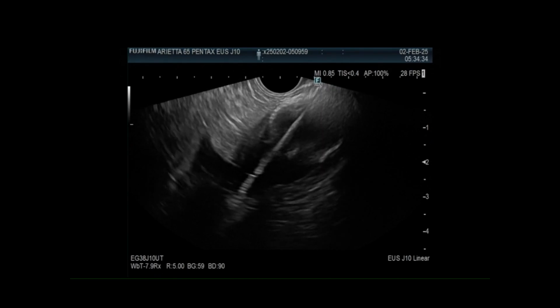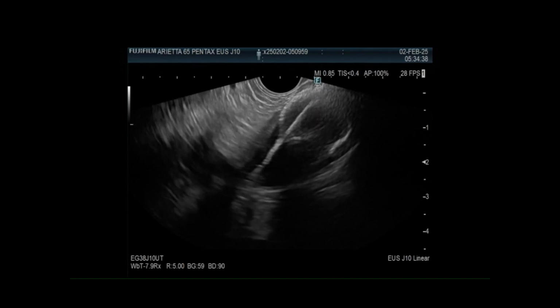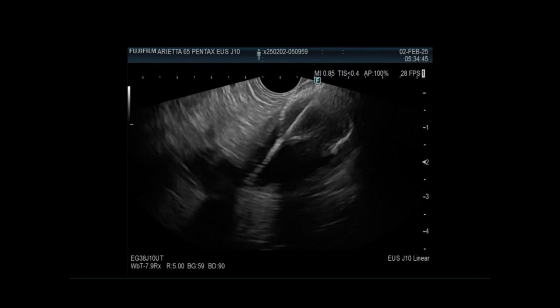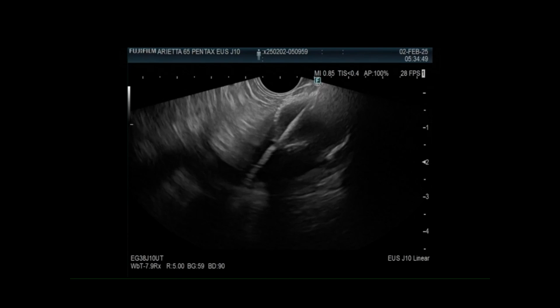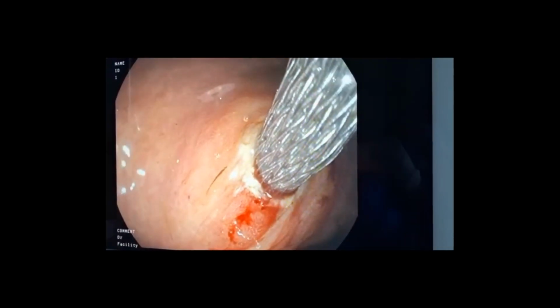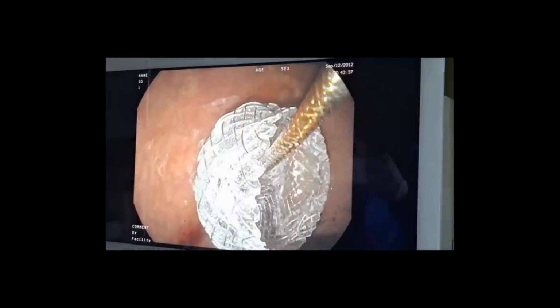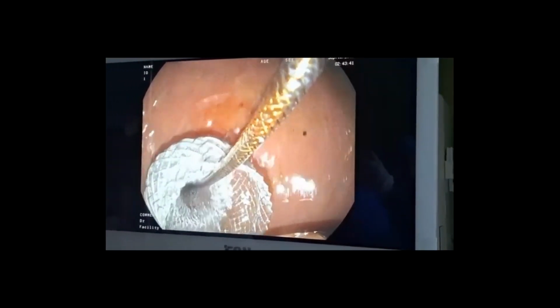We keep pushing the stent until one of the arms of the flange hits the delivery system, to be sure that there is complete apposition of the stent to the gastric wall. At that time, we open the proximal flange inside the endoscope channel to be sure that this flange opens inside the gastric lumen, and we slightly pull the scope back in order to see the stent.